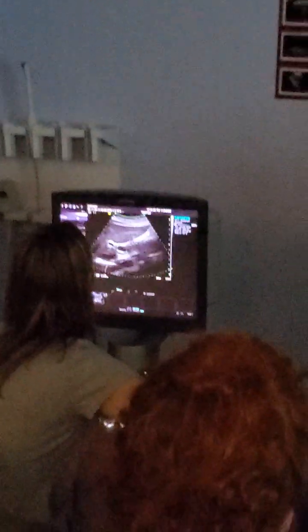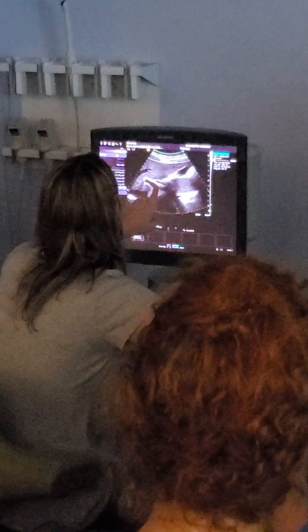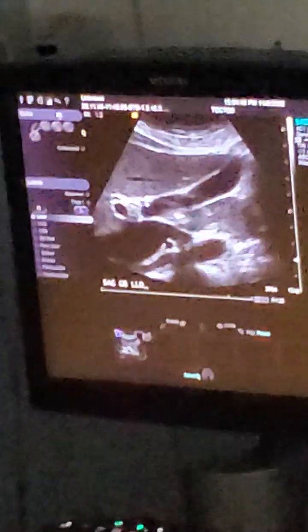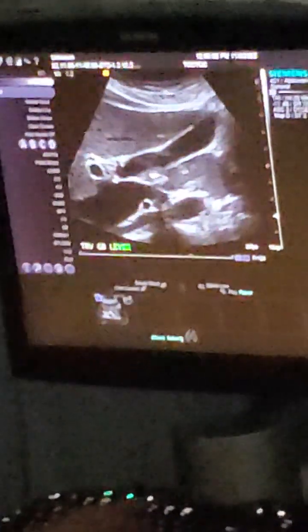So here we are, IVC. We've got that portal vein. So we're just going to follow that portal vein. And there it is. Window in. So then there it is out. Linked it out quite a bit, didn't it? We can actually see kind of the more subtlety of the neck where it goes into the cystic duct. So we're seeing a little bit better. So we'll take a representative here, and then we'll take 2 transverse LLDs. Doesn't matter if you're in the fundus or not, I don't care. Just representatives.